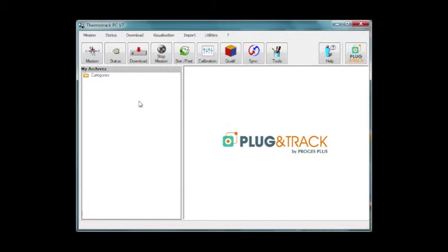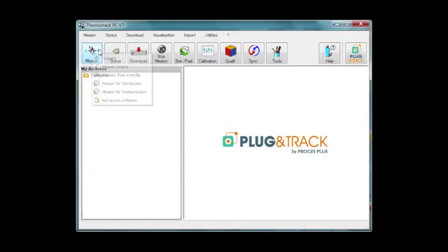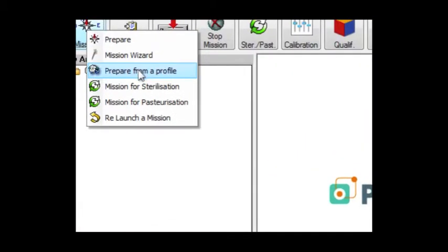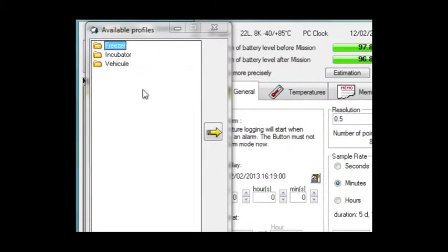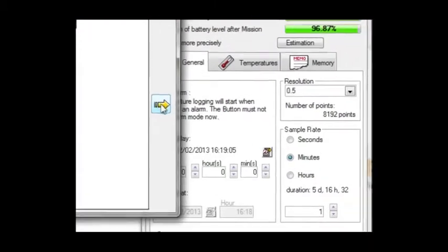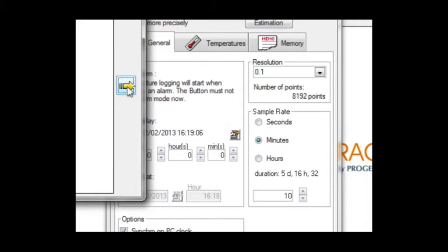The third possibility is to use a preset mission profile. Profiles are typical settings that you often use. You can create as many profiles as you like. Choose one of the profiles you have created, click the arrow and all the settings will be copied in the mission window.